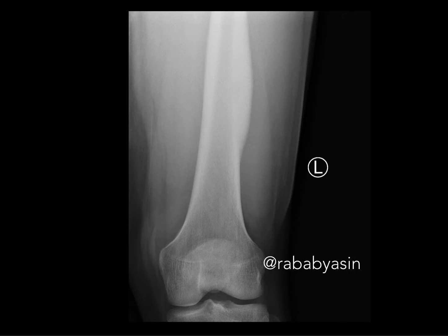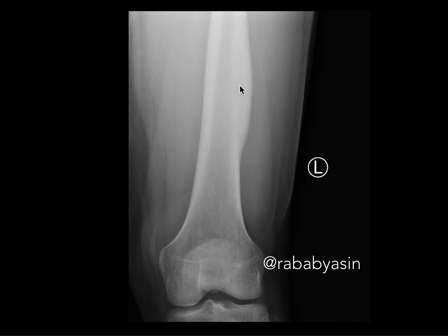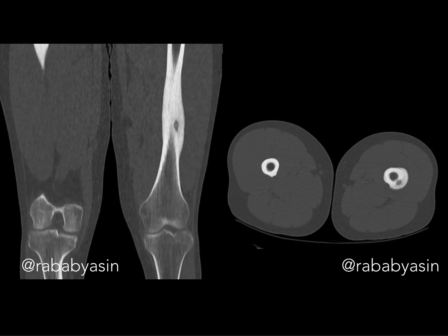Let us see with a classic example. This is a young male who presented with thigh pain with worsening pain in the night — this is a very classic presentation of osteoid osteoma. You can see the AP radiograph of the left femur, and the significant finding is the significant thickening of the cortex, which is smooth and solid — it doesn't look like an aggressive lesion.